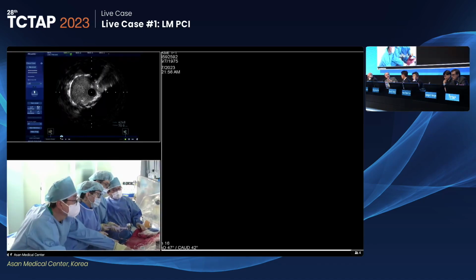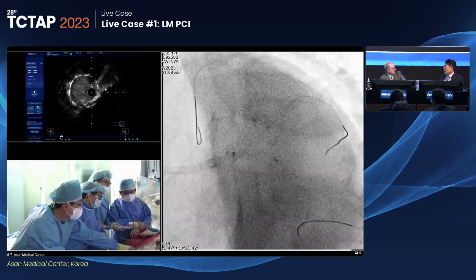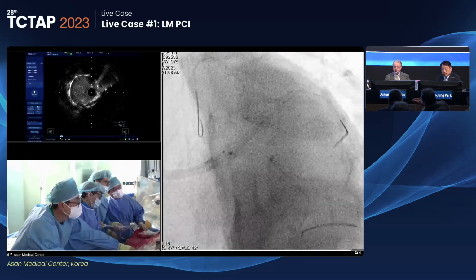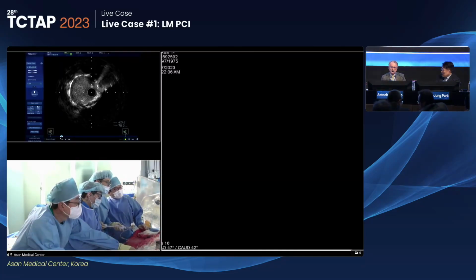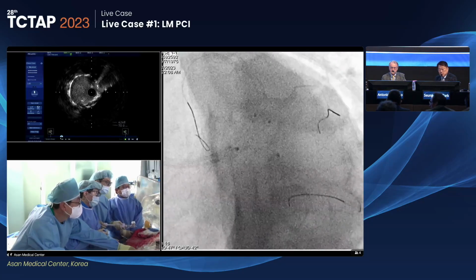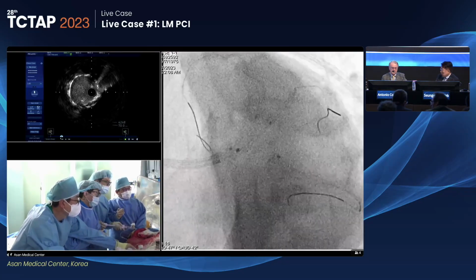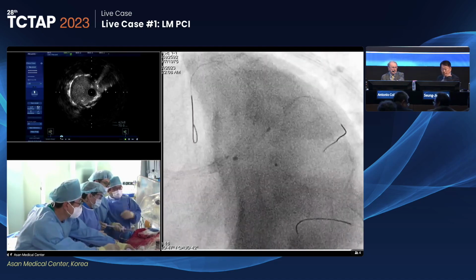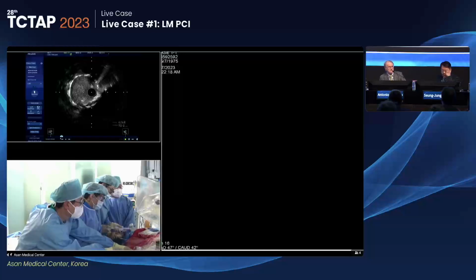Triple stenting, we always used to finish with high pressure. Diagonal triple balloon, 18. Inflation. Triple balloon inflation. It's okay? 18, yeah. Triple balloon 20, inflation. 24, especially if you have an 8 French guide. Deflation. Triple balloon inflation. It's not an old one, right? Yeah, that's fine. So even if you do 8, DCB, 8. Triple balloon inflation. All right.